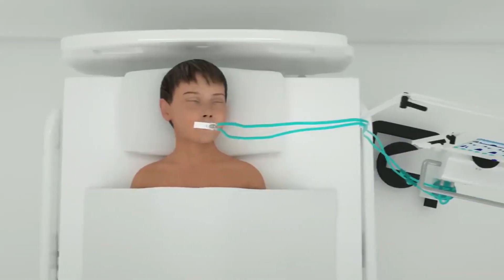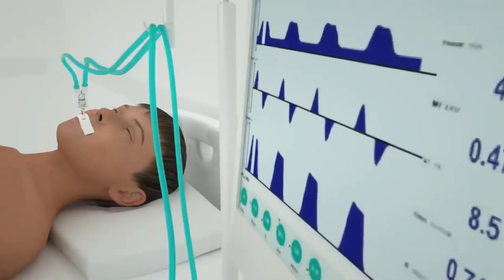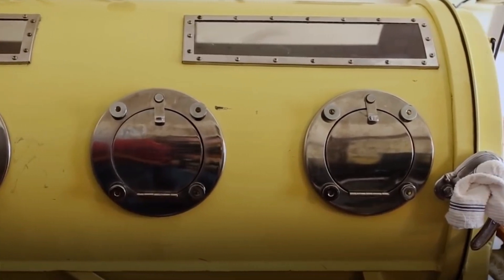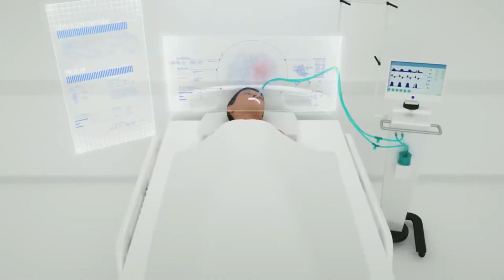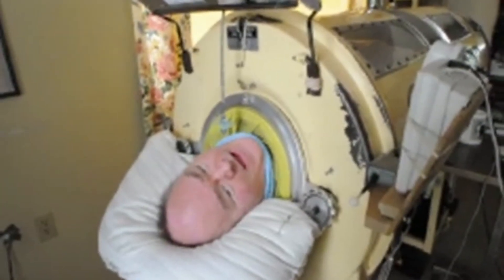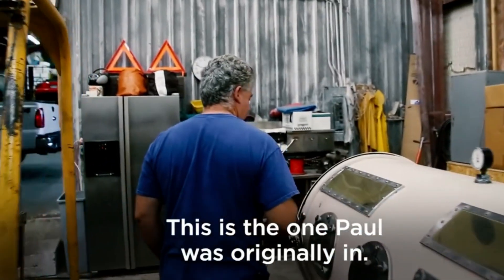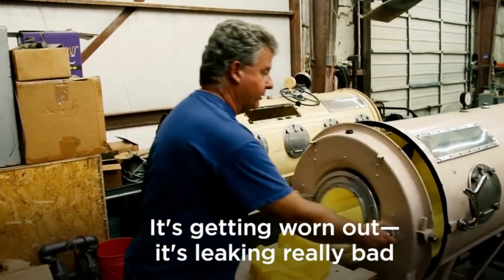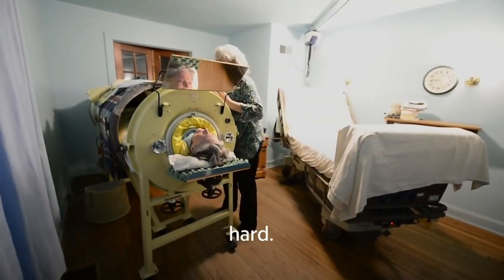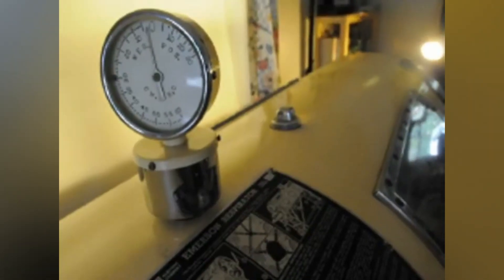Since modern technology has revolutionized the healthcare industry, respiratory devices like ventilators have become increasingly sophisticated. Have you ever wondered how the traditional iron lung machine differs from modern-day ventilators? Iron lungs have been used to treat various respiratory ailments for over a century. The traditional iron lung machine is a large cylindrical tank with a door that opens at one end. Patients would lie down inside the tank, and the machine would force air in and out of their lungs by altering the pressure within the chamber.